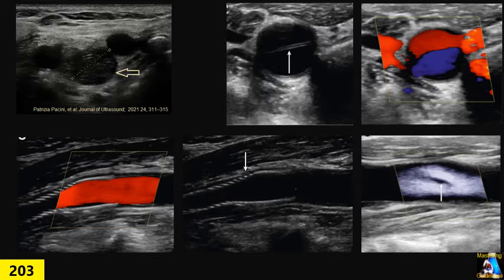Besides any lesion that we see in the carotid, usually plaque, we have to be aware of other pathology when we scan the carotid. At the top of them is dissection of the carotid, which can show as a flap. It can be very sharp and flail, independent of movement of the wall, and if we move around to a different angle, it will still be there.